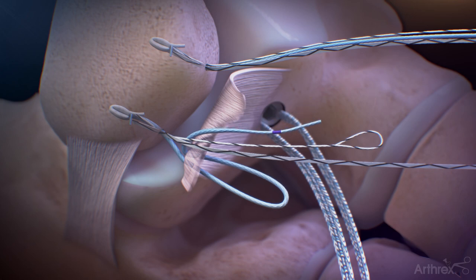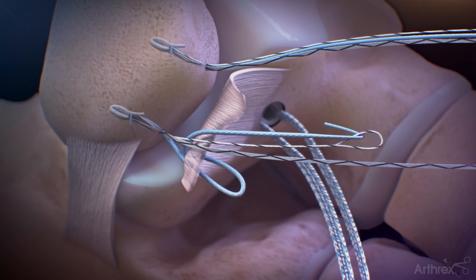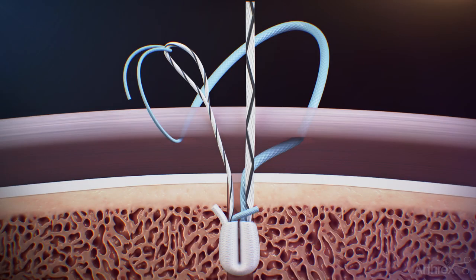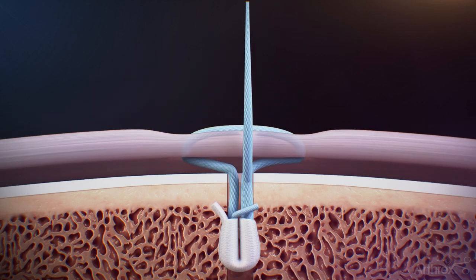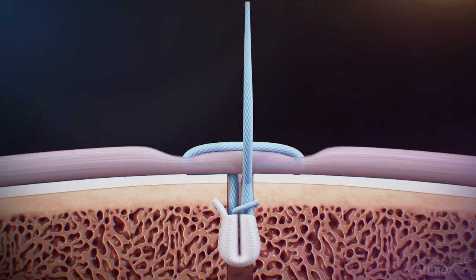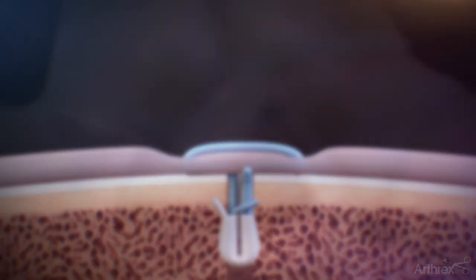Double over the blue working stitch through the loop end of the shuttling stitch at the purple marking and pinch and hold the sutures. Pull axially on the tape end of the shuttling stitch in line with the anchor using short jigs until the blue working suture and shuttle loop are converted through the anchor. Place the foot in the desired position and continue to pull gently in an axial motion until the desired tension is met.